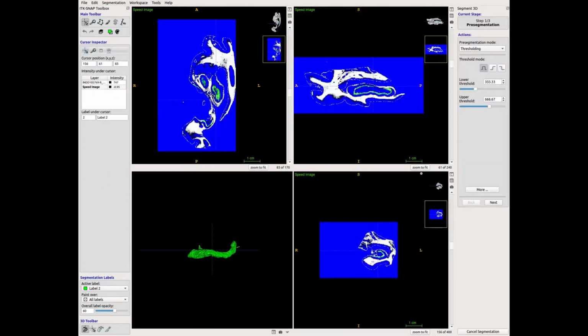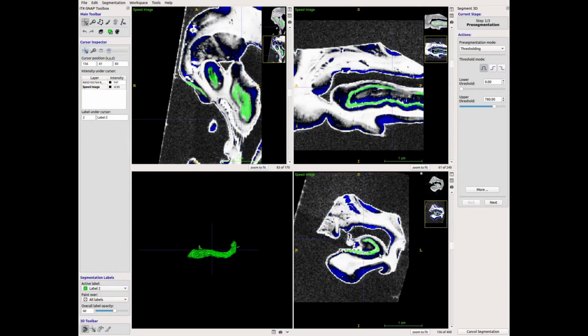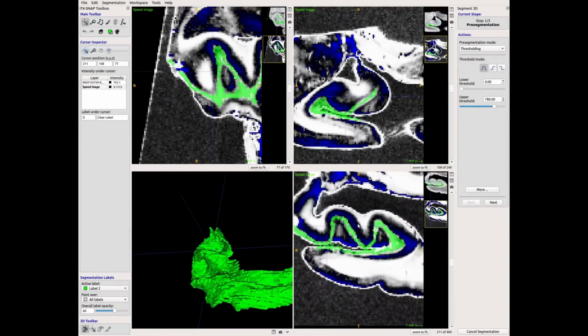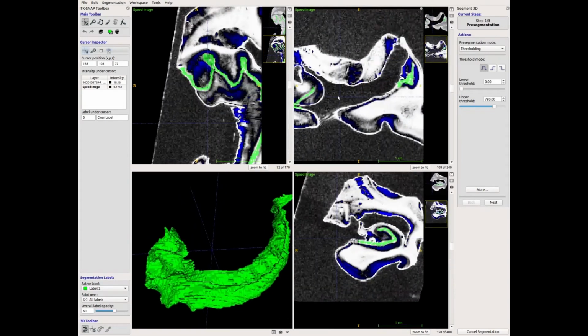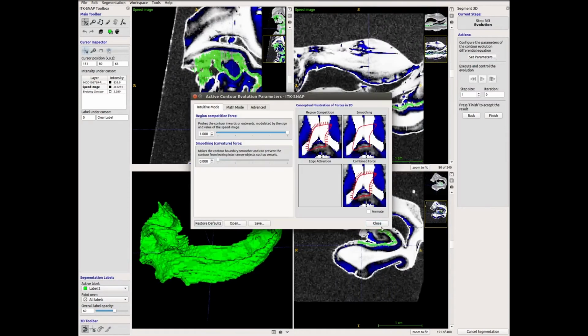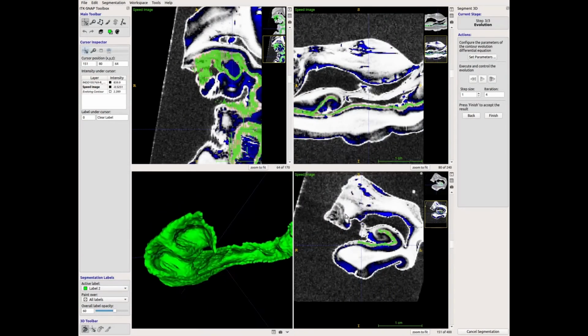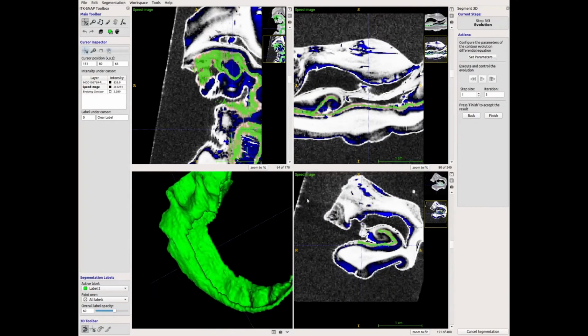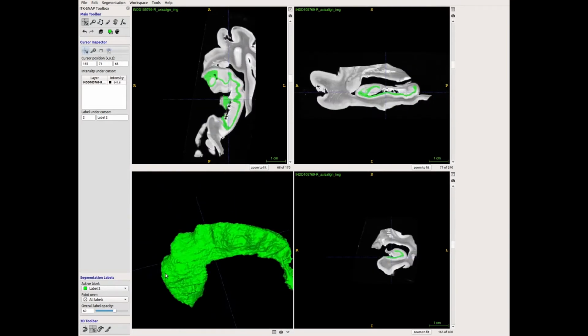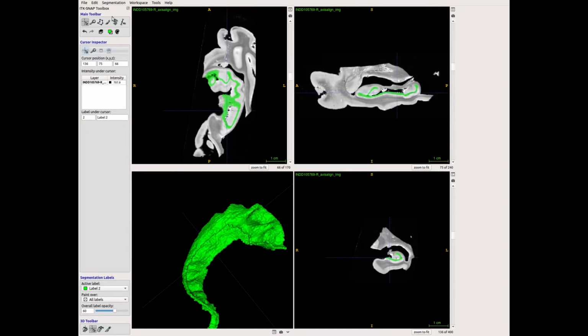Okay, so here I'm using some of the fancier tools in ITK-SNAP. So this is an erosion and dilation tool that I'm also thresholding the image a little bit with as well. So basically it will allow this label to expand within the white zone, but not in the blue zone. So I've adjusted the thresholds to follow those rules and just capture the darkness of the dark band there, or the SRLM.